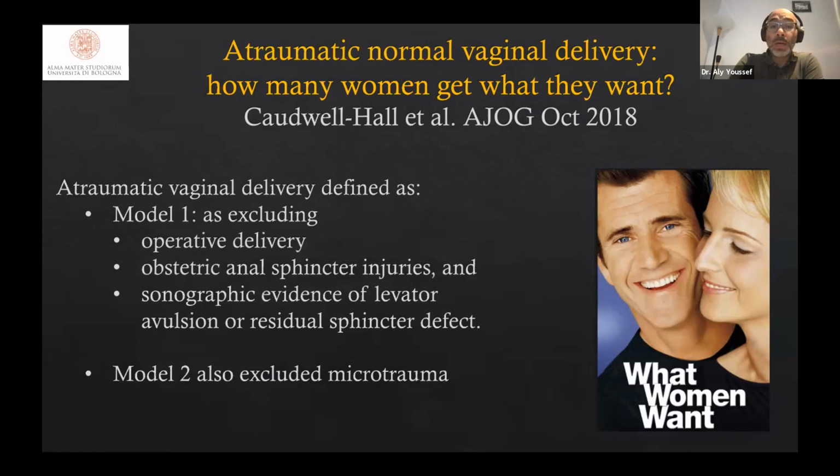They hypothesized that women do not want an instrumental delivery, an obstetric anal sphincter injury, or an ultrasonographically diagnosed levator ani avulsion, which is detachment of the levator ani muscle from its insertion, or sphincteric damage diagnosed by ultrasound.